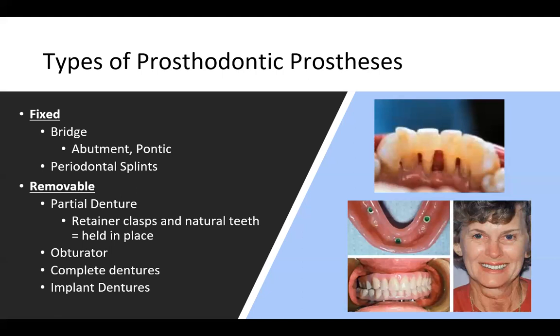And like the notes say here on the side, there are things like just eating the food, of course, but also tasting the food. It affects taste because the dentures cover up some natural taste buds, especially in the palatal area. That's going to cover a big portion. And sometimes they can feel like the denture is so large that they're gagging on it. I've had patients say, "I can't wear it, it makes me gag," or it just feels weird in their mouth.